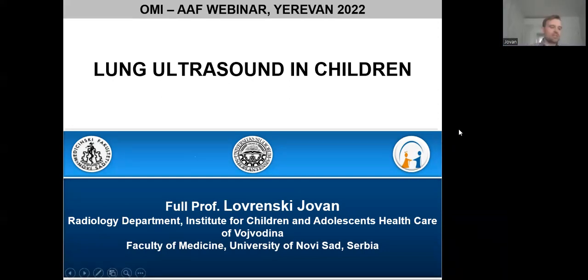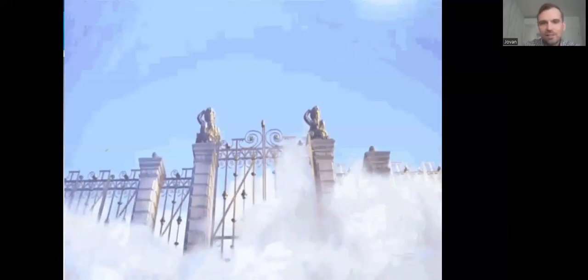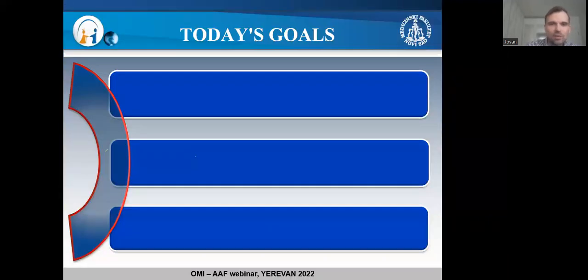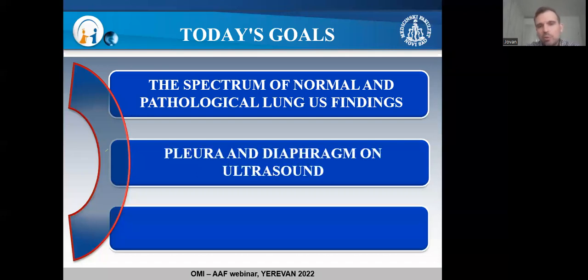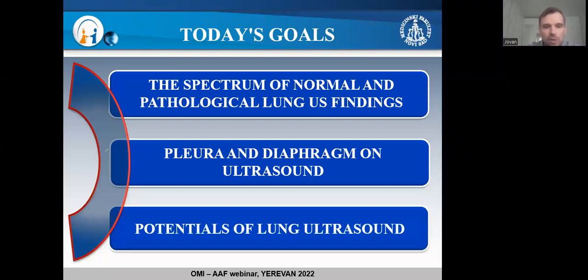Okay, thanks a lot. So, as I said, dear colleagues, today we are opening the gates to pediatric lung ultrasound, one of my favorite professional topics. And here are today's goals. First of all, we're going to go through the whole spectrum of normal and pathological lung ultrasound findings. Then we will talk a bit about pleura and diaphragm on ultrasound, and we will finish with potentials of pediatric lung ultrasound and lung ultrasound in general.